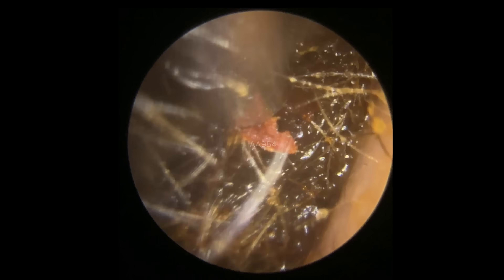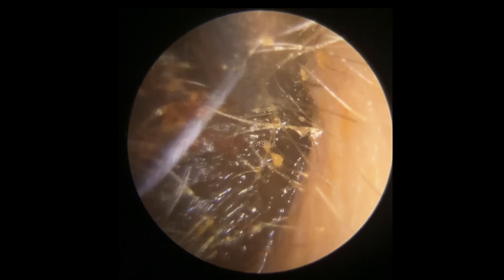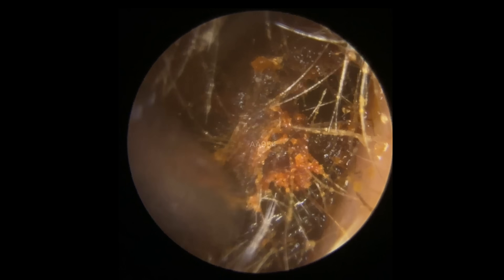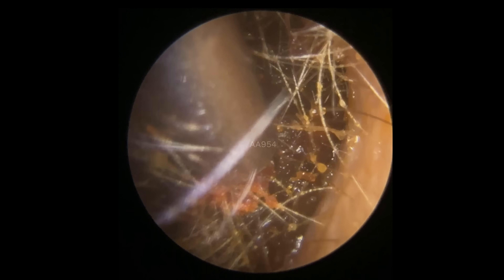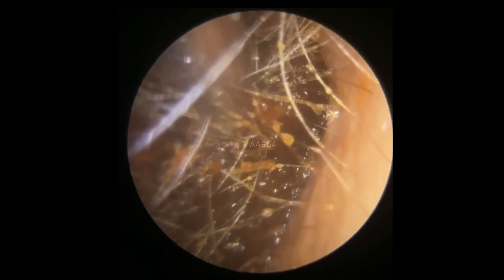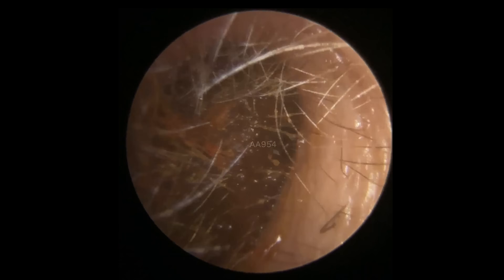As I'm trying to pull this down, the piece that's wrapped around the second bend in the canal is holding this in place. I've got the standard size Zollner tube in here and I'm just lifting from the canal wall, trying to maneuver this out. You can really make out all those individual hairs running the whole way through this wax plug. That's probably because of a little bit of ear hair trimming — those thicker, coarser hairs on the outer portion of the ear canal have gone back in and the wax has picked them all up.